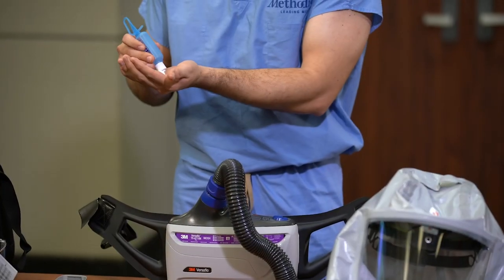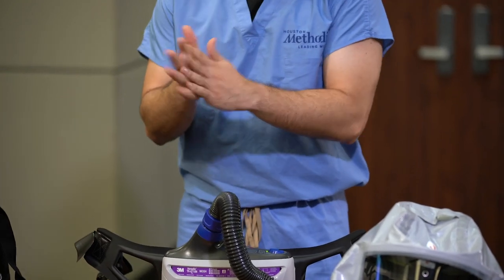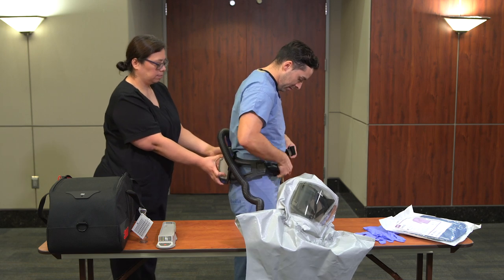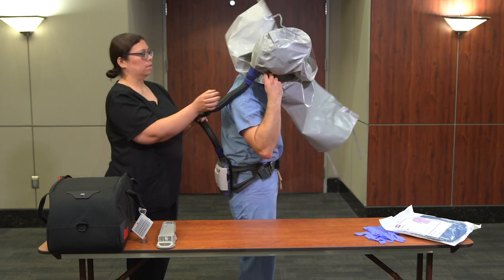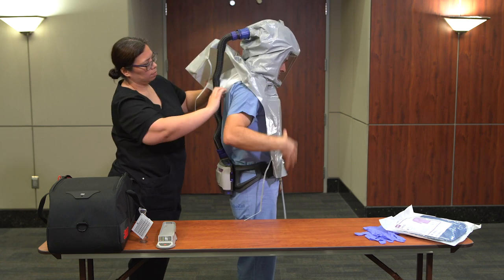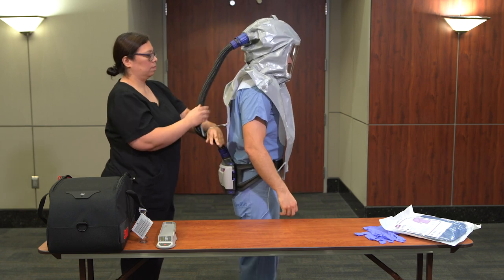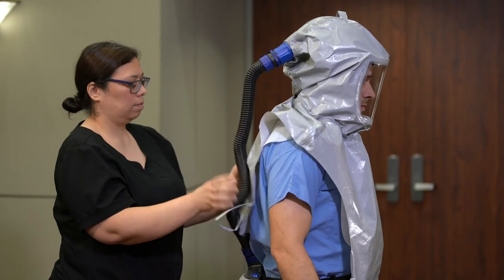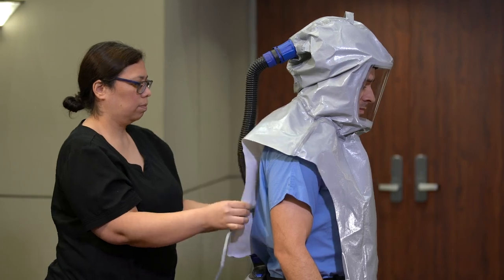Perform hand hygiene using alcohol-based hand gel or soap and water. With assistance from a buddy, don the device belt with fan assembly. Place the PAPR head cover on and ensure the harness is securely positioned around the forehead and the back of the head. The shroud attached to the head cover should be worn under the gown specified in the next step.